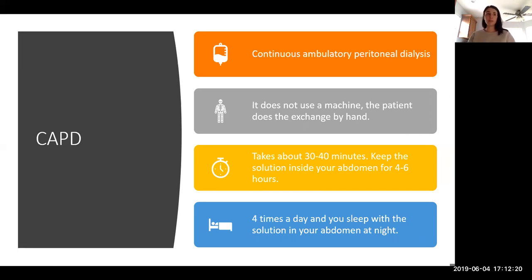But one big thing is, before you put this solution into someone, make sure it is warm. There are special warmers to use to warm this fluid. You do not want to put cold solution into somebody. It can cause them to shiver and not feel well.